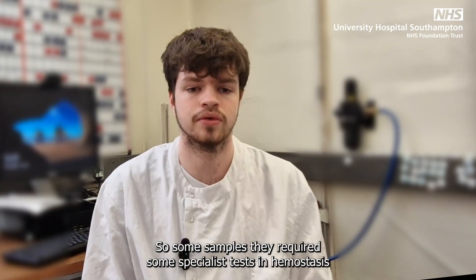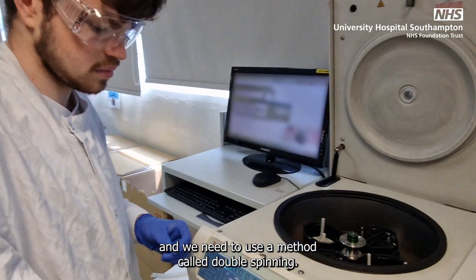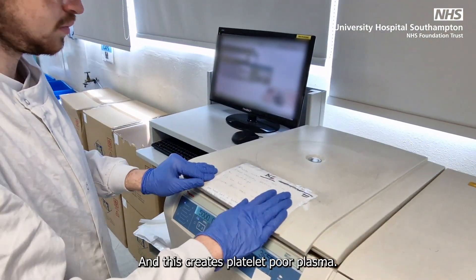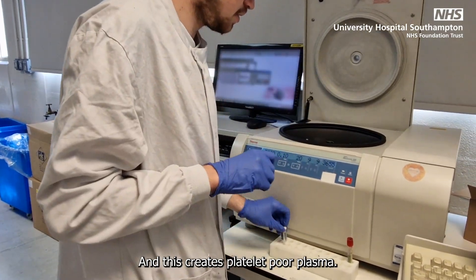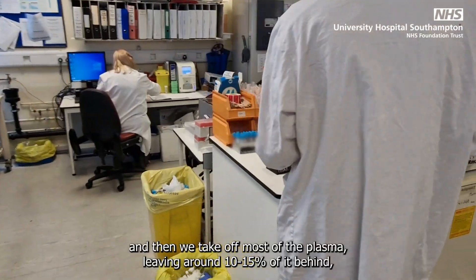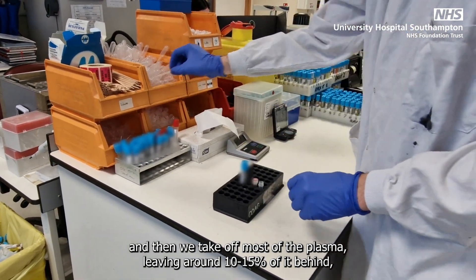Some samples require specialist tests in the hemostasis, and we need to use a method called double spinning, which creates platelet-poor plasma. We spin the sample initially, and then we take off most of the plasma, leaving around 10 to 15 percent of it behind.